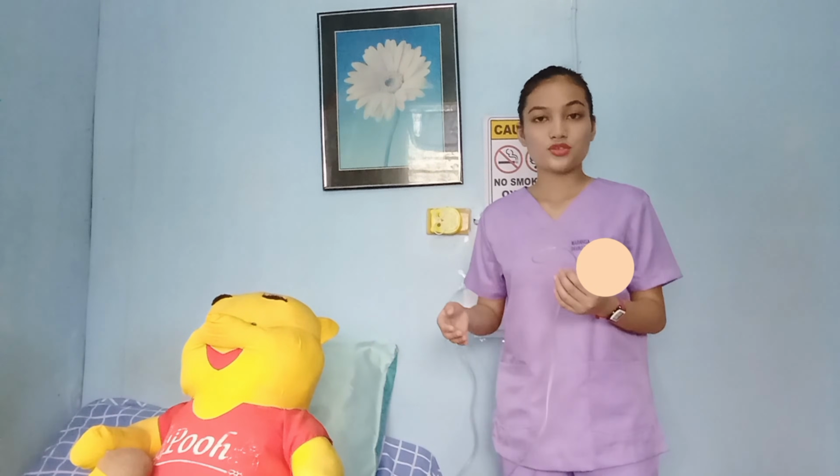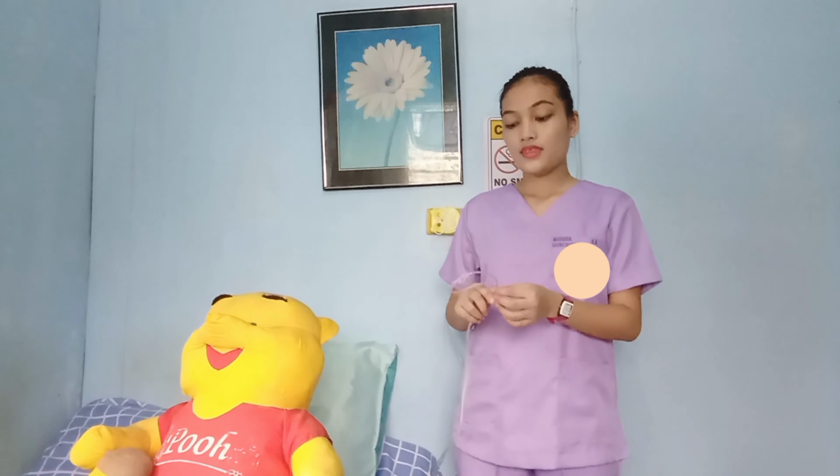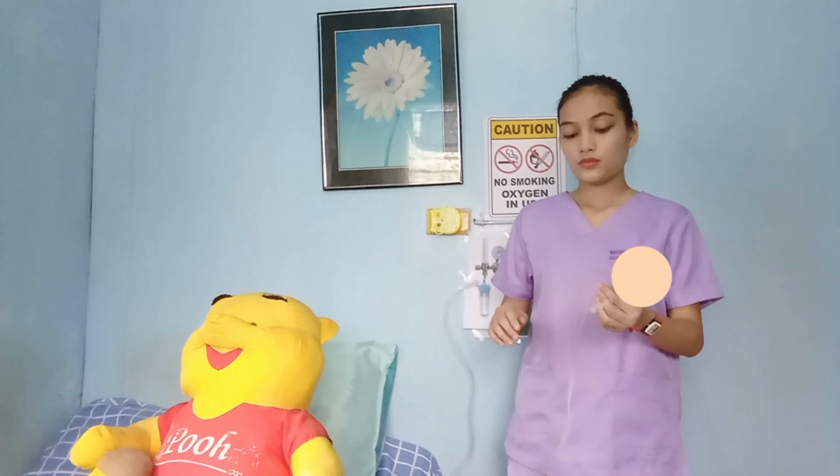So for this demonstration, our flow rate is at 2 liters per minute. Okay, now that we're done setting up the equipment, next thing to do is to appropriately apply this nasal cannula to our patient. So what we are going to do is to put the cannula over our patient's face with the outlet prongs into the nares and the tubing hooked around the ear.